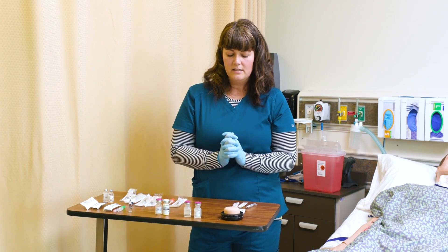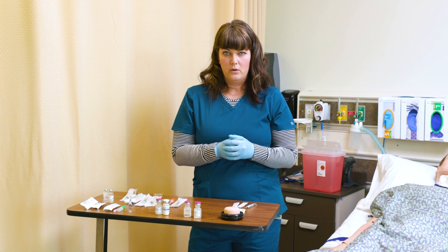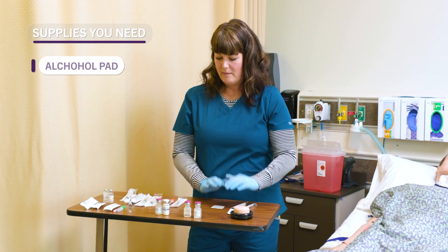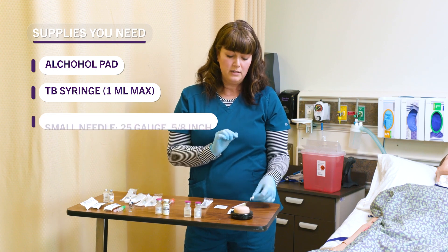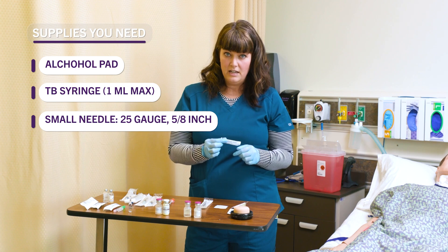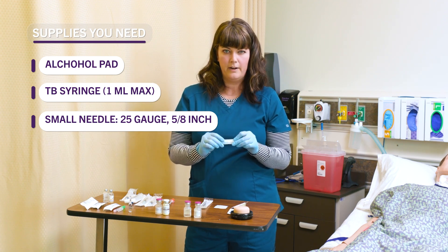Let's talk about what size of needle we're going to need, what size of syringe, and the angle we're going to use. First of all, I'm going to need my alcohol pad, a TB syringe which is one milliliter maximum, and a very, very small needle. The needle I'm going to choose is a 25 gauge 5/8 inch — a very small, very fine needle.